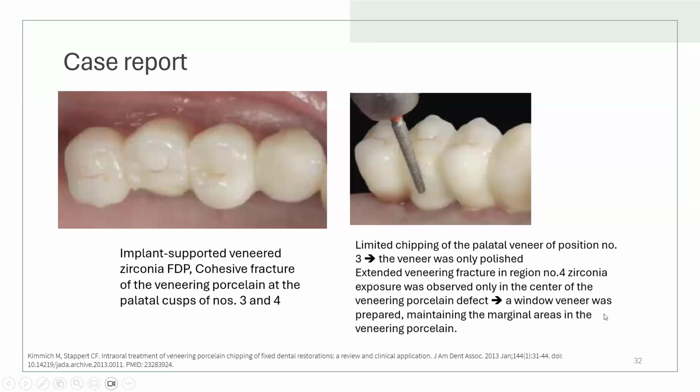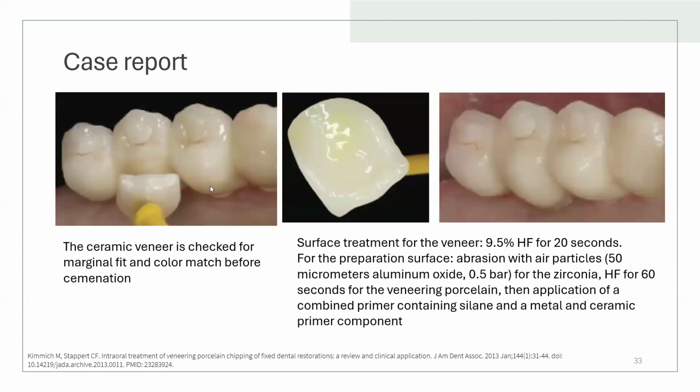So they did a window veneer preparation, and they maintained all the marginal areas. All these areas are within porcelain, so the margins are porcelain all around. Okay, here are the fabricated veneers. Here it's checked for the marginal fit and the color matching.